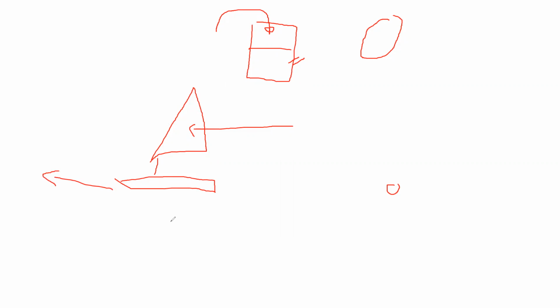So they were sailing one day and they said, you know what? It probably is going to be okay to migrate into the pulmonary artery so that we could measure left-sided pressures by having a catheter and designing this catheter so that when we inflate it, we need not push the catheter to go into the pulmonary artery, but rather we will rely on the movement of blood to propel it from the right atrium to the right ventricle and then into the tributary of the pulmonary artery.